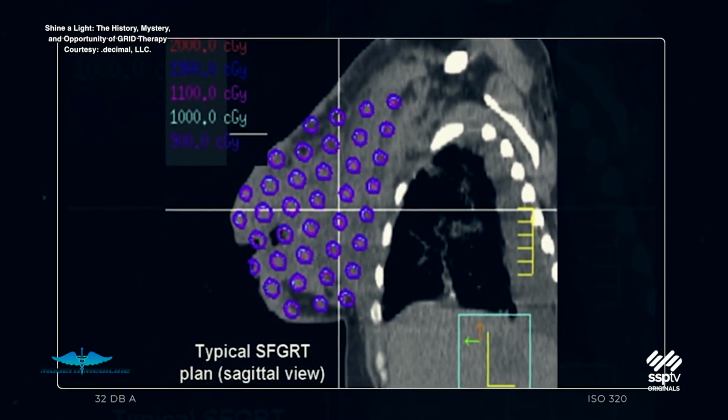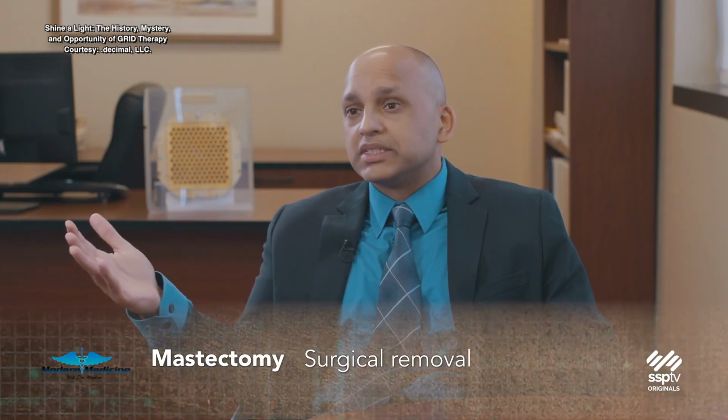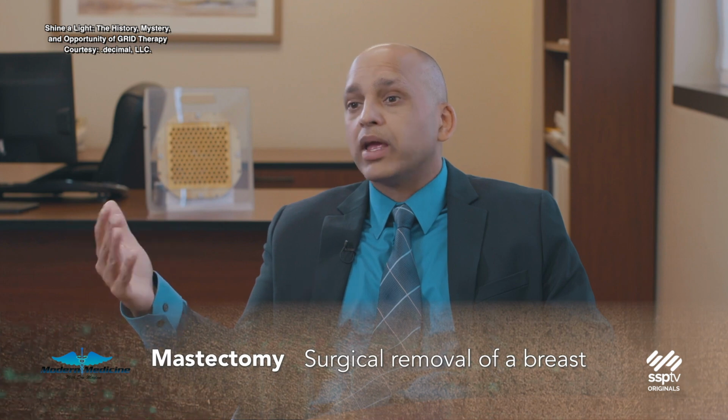And this patient had been through chemotherapy. When you have a large tumor that's this big and it's pretty much outstripped its blood supply, even if you give chemotherapy, it's not getting to the tumor. The tumor is necrotic. So I gave the grid treatment. I think it was 18 gray, and I followed it with conventional radiation 50 gray. And she never had surgery. But what was nice was about 3 months later, when they did a CT scan, the reading by the radiologist who never saw the patient said, "interval mastectomy." That's how they read it.